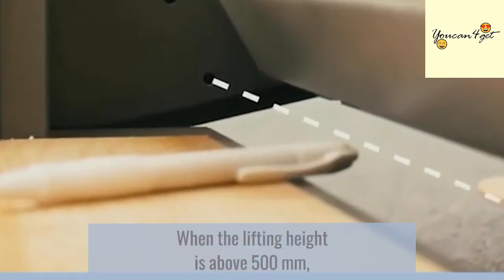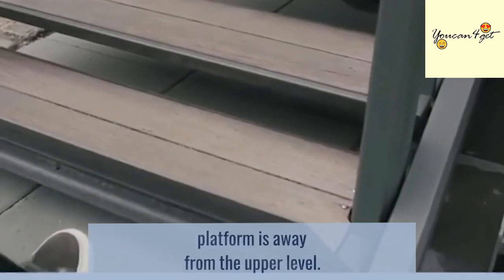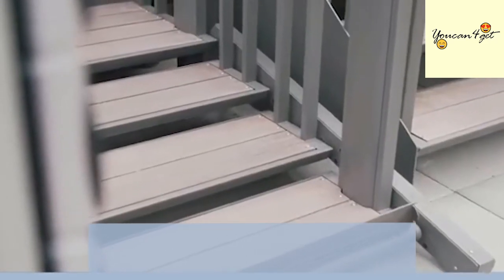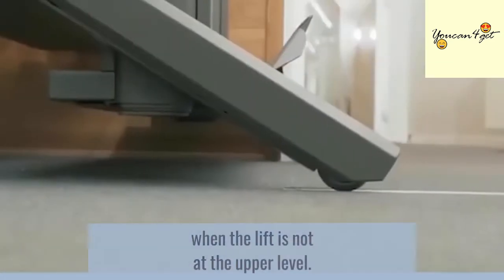When the lifting height is above 500 mm, the barrier is used at the top landing. This prevents users from falling down when the platform is away from the upper level. The vertical safety barrier will always be closed when the lift is not at the upper level.